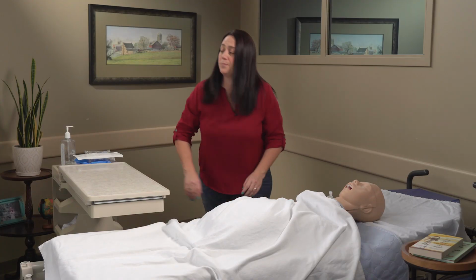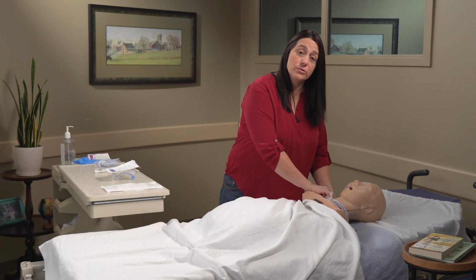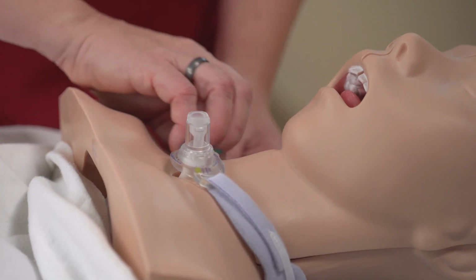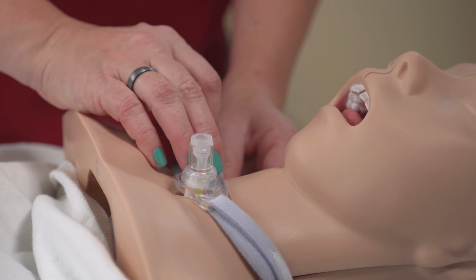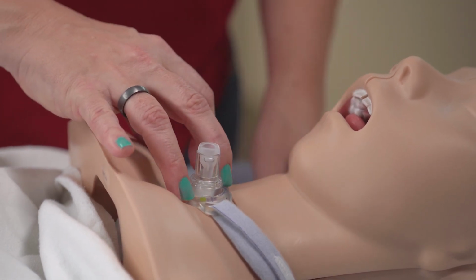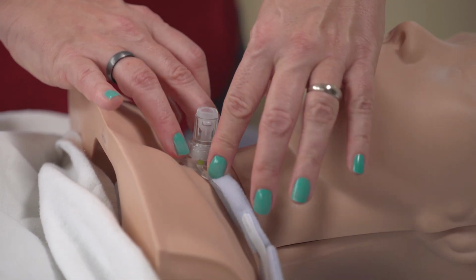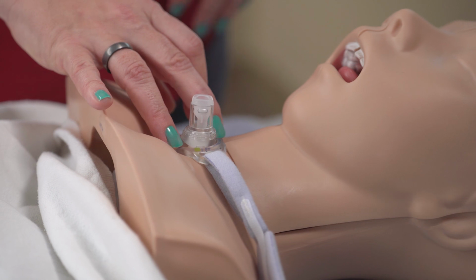So this individual, I'm not needing to deflate their trach, so I'm not going to have to deflate and connect to their balloon ahead of time. When I'm ready to remove it, I'll be able to remove it. So to help myself, before I begin, I can undo these trach ties so that when I'm ready to remove the old trach, that's possible. So I'm going to have one finger here holding it in place so I'm not jostling it while I'm removing that tie. The other one I can just pull out from behind and it can be sitting right there so that I'm ready to go.